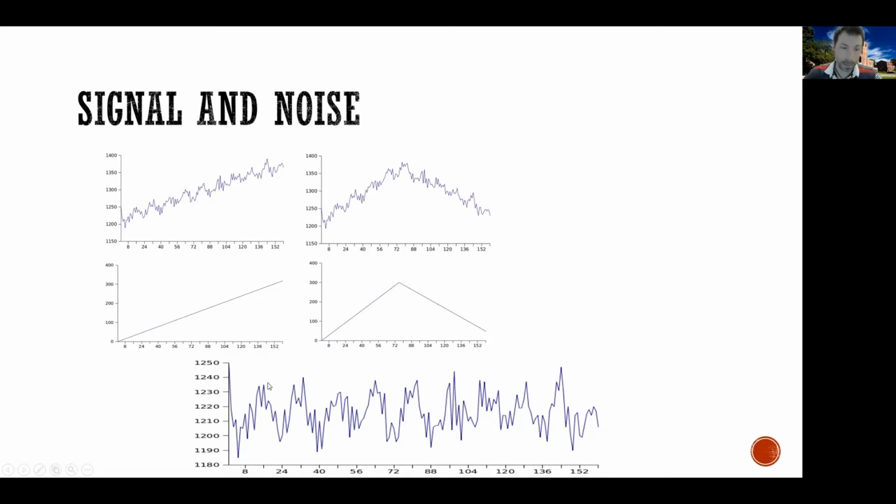And remember what we said? I can explain the ups and downs every 16 seconds in this task, because in this time series, that was my task. I can't explain why it slowly drifts up. That is low frequency noise. I can't explain why it goes a little up and a little down. That is low frequency noise. I gotta get rid of it.